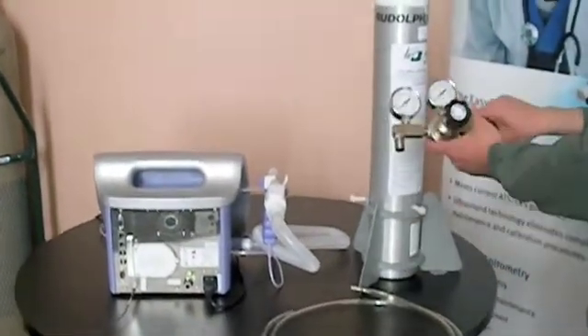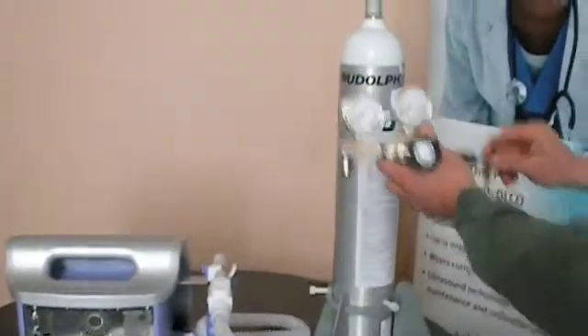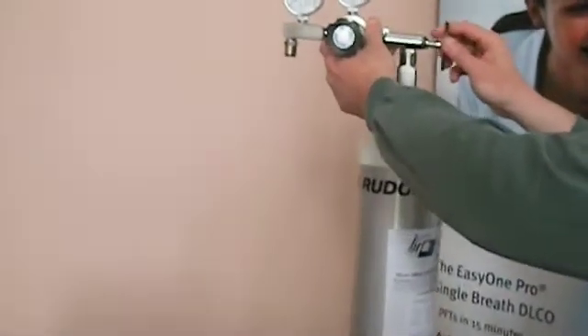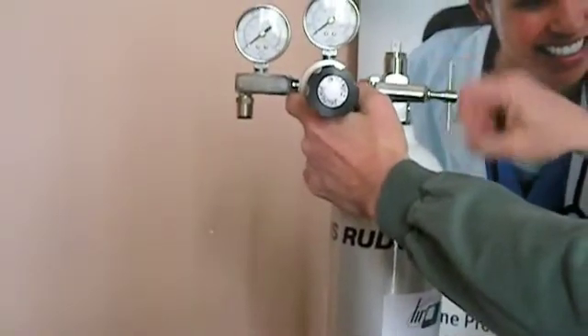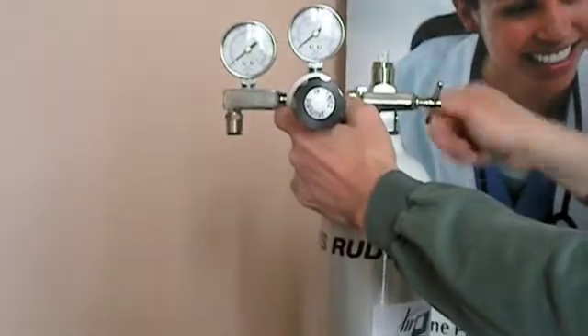First thing we need to do is connect our E-size regulator to the top. Slide it on, put it in the two grooves that are provided on the bottle, and tighten it as tight as it can be.